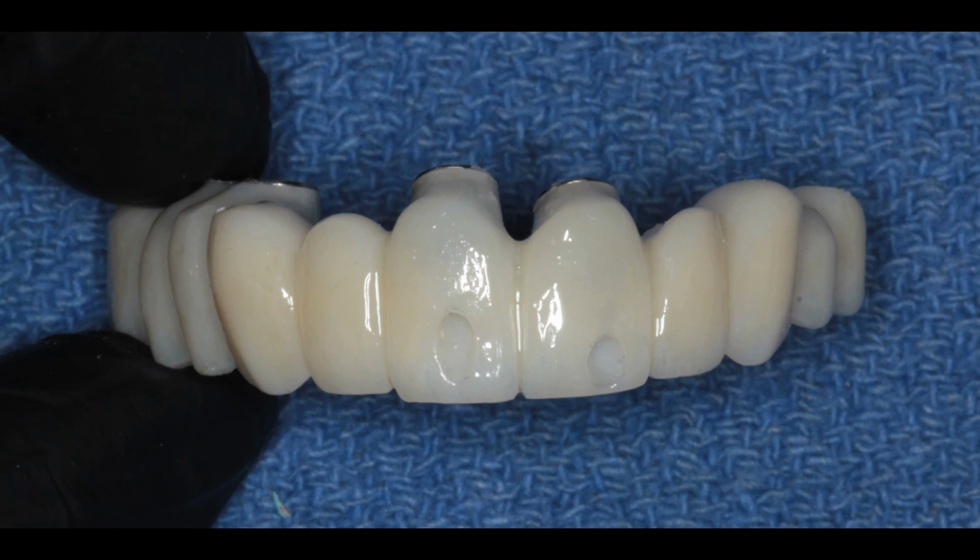And again, you'll occasionally see the screw holes through the front of the temporaries, and we use a different kind of abutment on the final restorations, and those are now invisible. They're behind the teeth when we're finally finished. The reason I'm showing all of these temporaries is to show you all of the convex surfaces which create the shaping of the tissues.